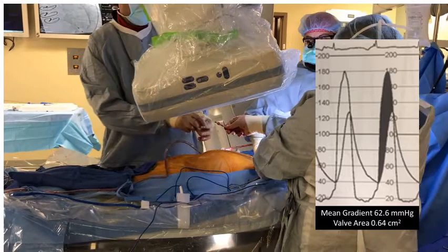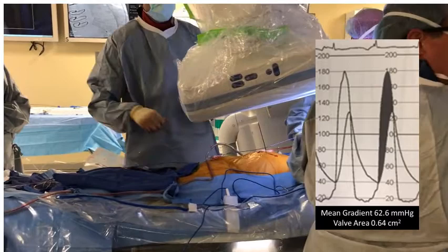The wire is exchanged for a pigtail catheter for left heart catheterization and hemodynamics. In this case, we had a gradient of 63 millimeters of mercury with a valve area of 0.6.